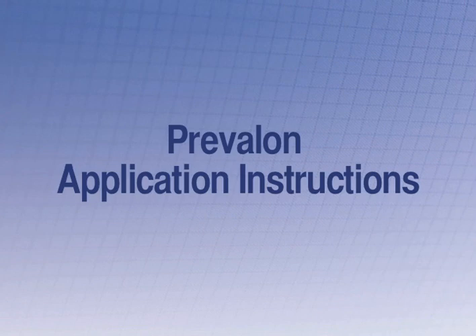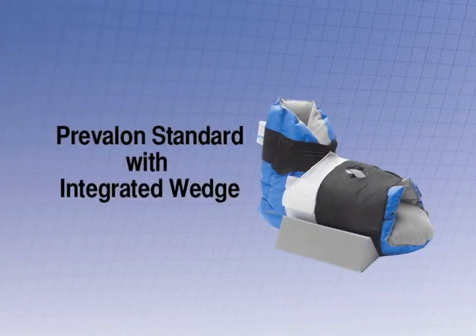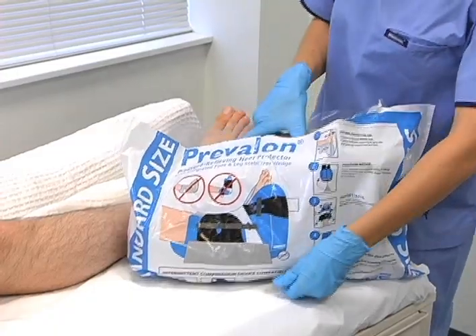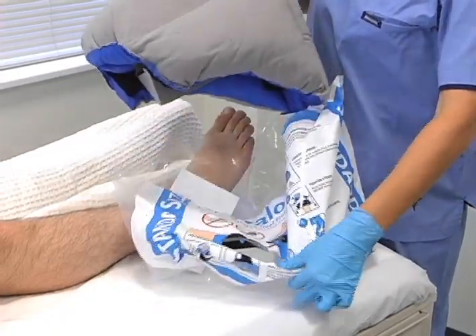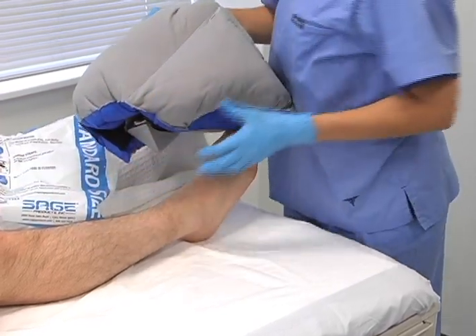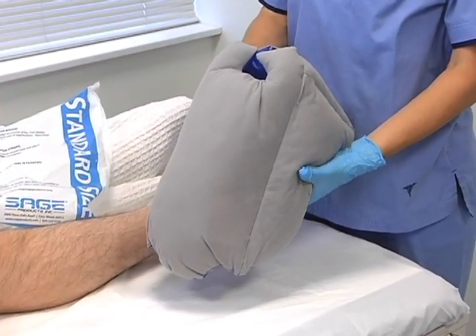Now we'd like to show you how simple it is to properly apply Prevalon. This video features Prevalon Standard with integrated wedge, although application instructions are the same for all three sizes. To begin, open the bag at the perforation. Instructions are printed on the bag and can be referred to at any time. Prevalon is packaged inside out to make it easy to properly position the heel.